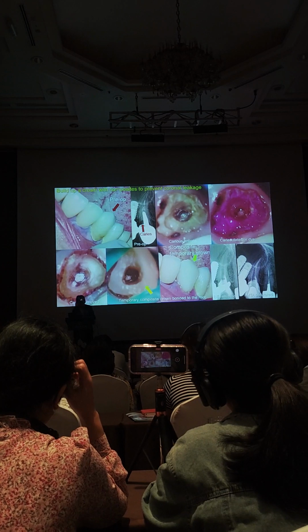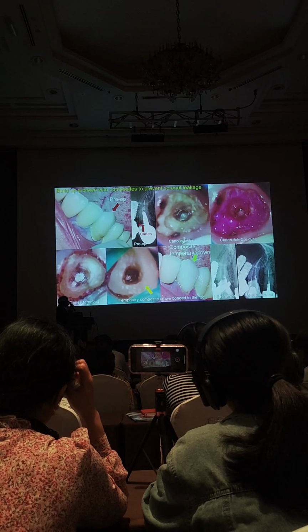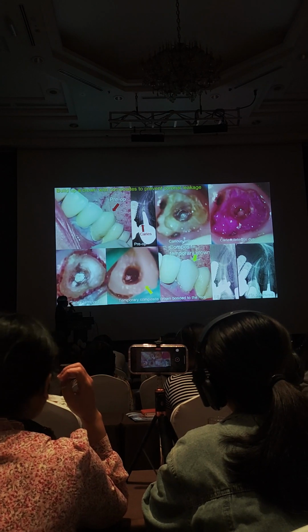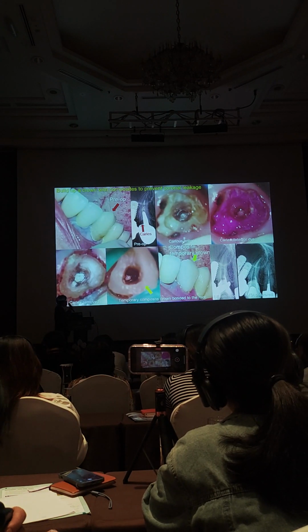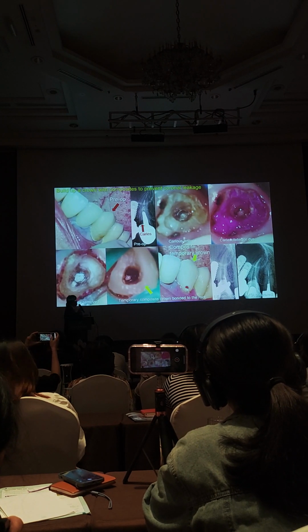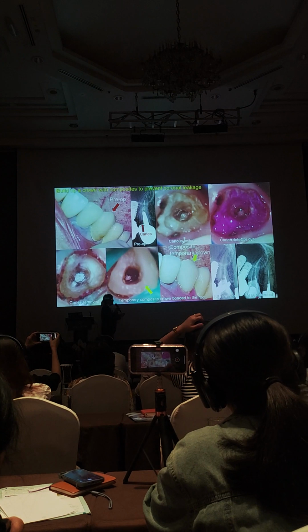So this is a good example. Look at them. You see the defect between the coronal restoration and the root. So that's why I stain the dentin. You see lots of red areas here showing the soft dentin. So I removed it, and I retreated in one visit.